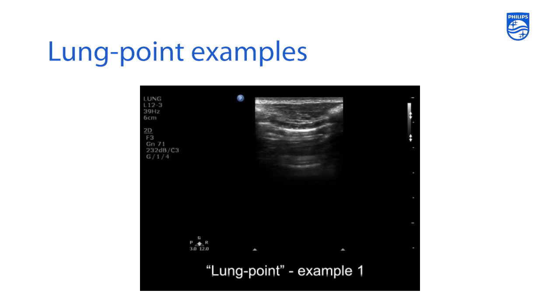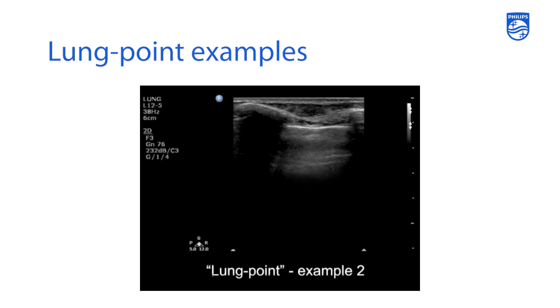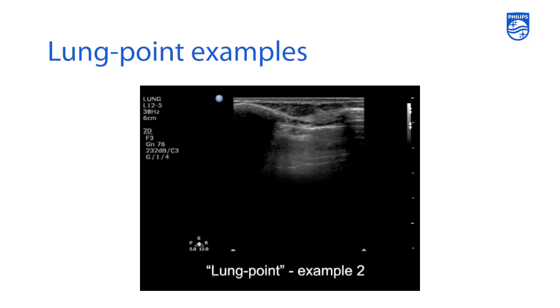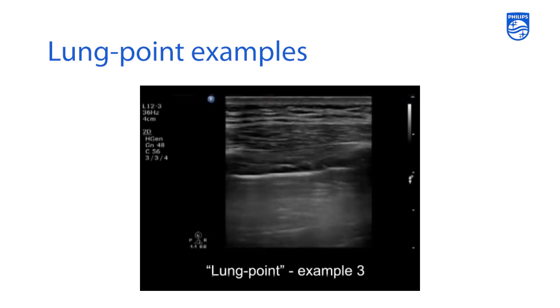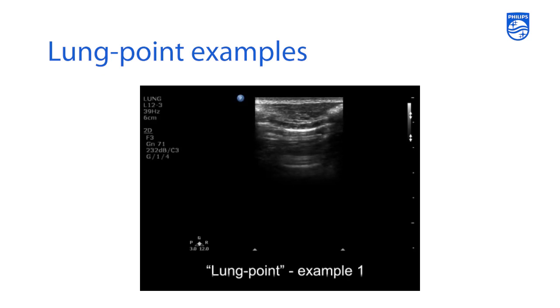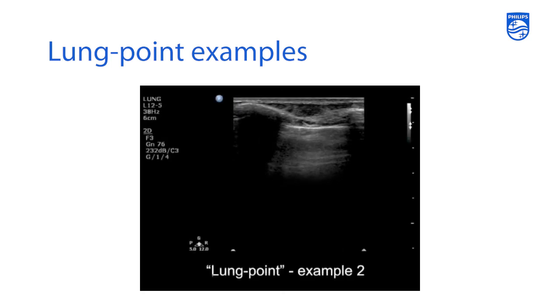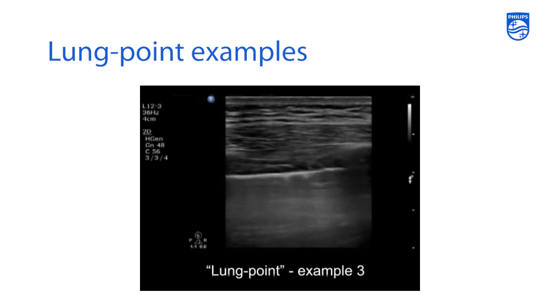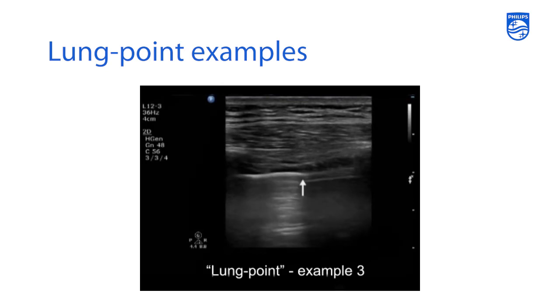In real-time scanning, you see at the top of the screen this bright pleural line that comes in and slides back and forth, makes contact with the top of the screen, then slides away. There is this point of contact between the visceral and parietal pleura where you have sliding, and then it disappears and comes back — disappears and comes back. Here you see that bright line, and watch: the arrow marker goes away and it comes back. This is an example of lung point. If a patient has a lung point, you can be assured that they have a pneumothorax.